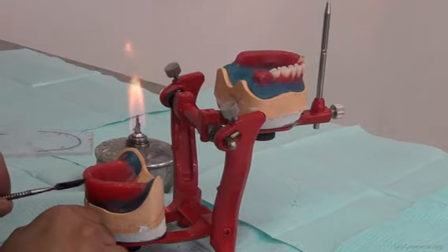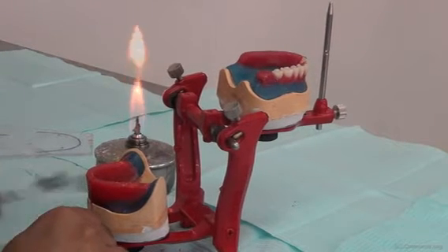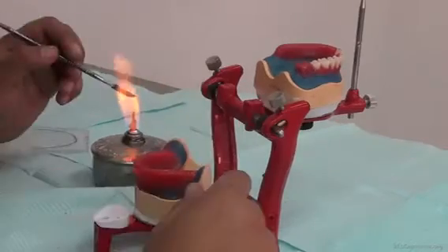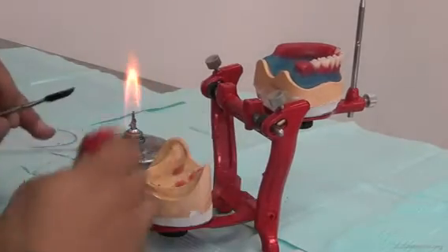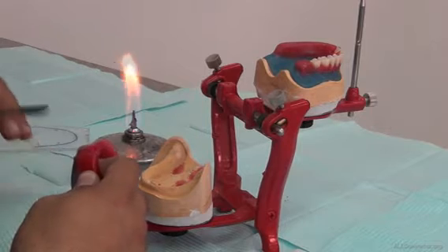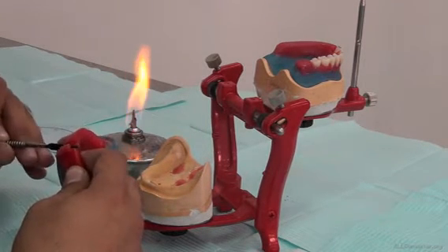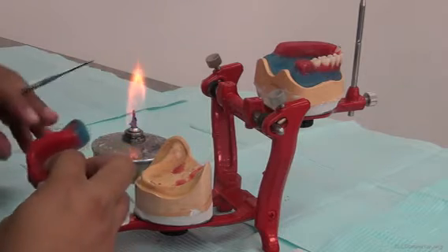We're going to open the box for one central, add it, and then add the other central on the other side.